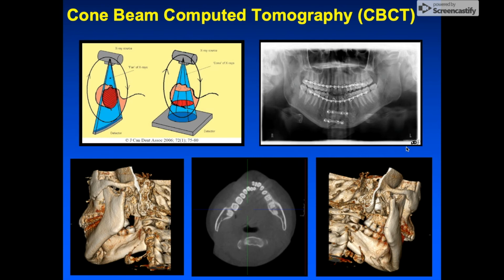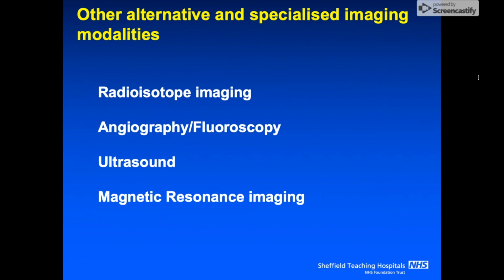Post-operative imaging demonstrates reduction and fixation of mandibular symphysis fracture and the placement of arch bars, which are here. Other alternative and specialized imaging modalities include radioisotope imaging, angiography, fluoroscopy, ultrasound, magnetic resonance imaging.